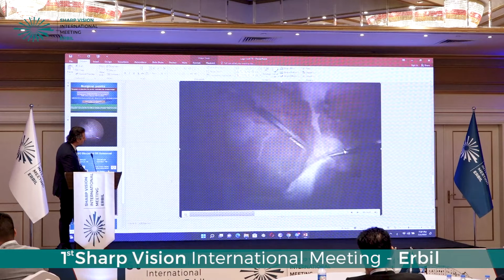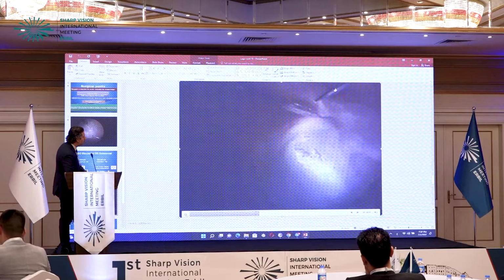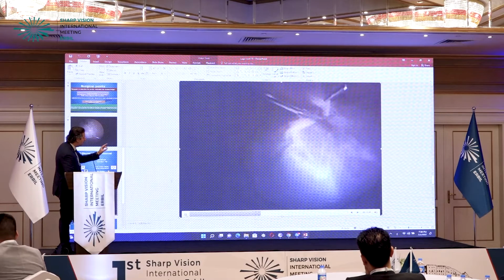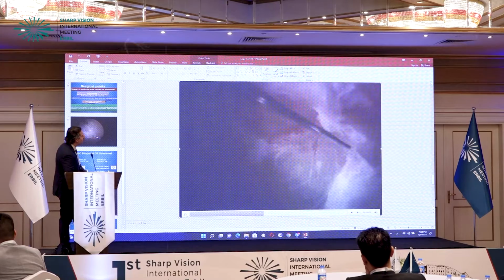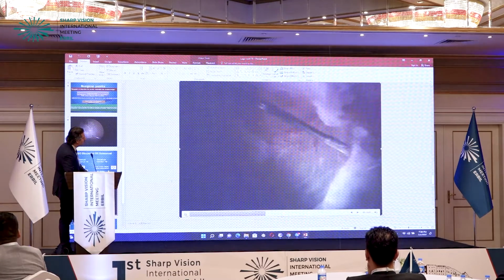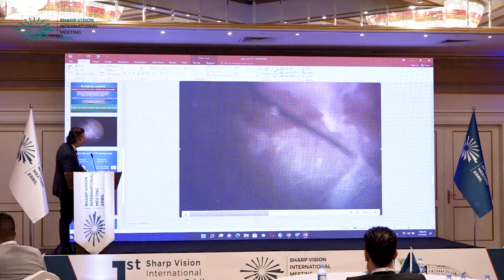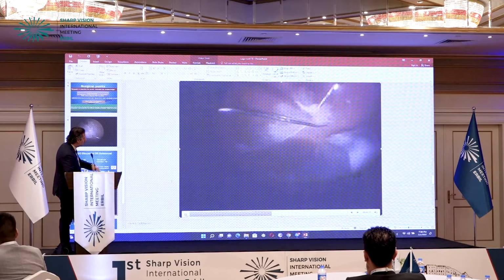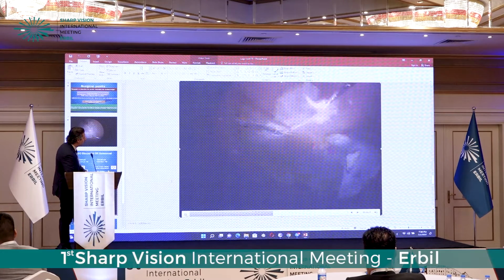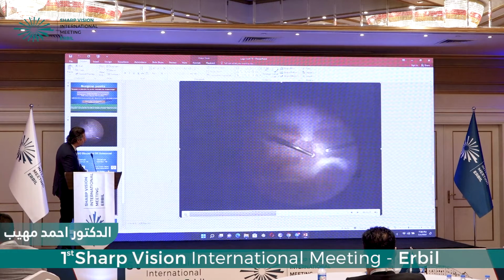You should be as patient as you can. In my point of view, don't hurry to the cutter. You can take it piece by piece in this bimanual way. Here, blunt dissection to separate the retina from the vitreous. And I can see the connecting points and cut them sharply. The large membrane is separated into two halves.